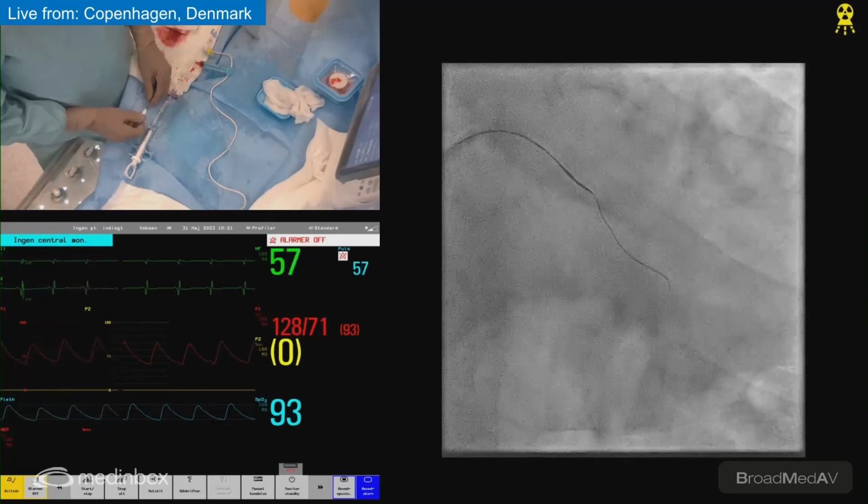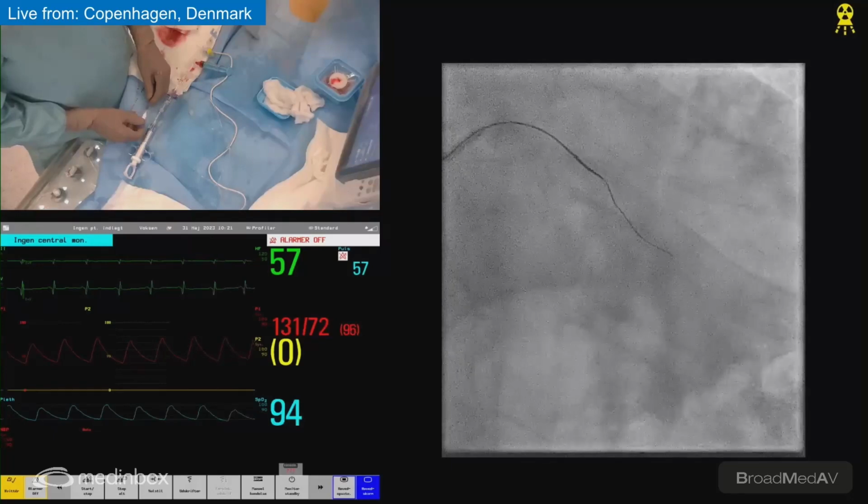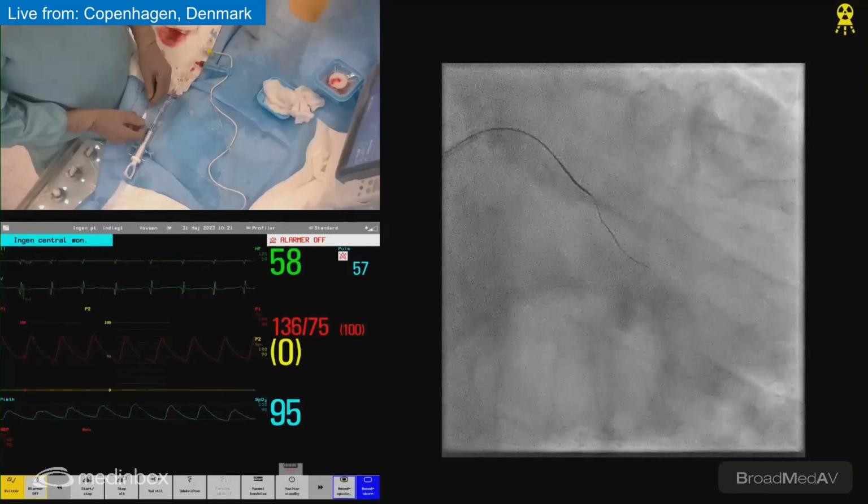Want a Fine Cross or a Sasuke? We'll take the Sasuke double lumen catheter.